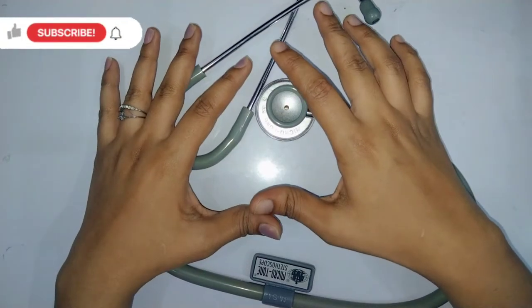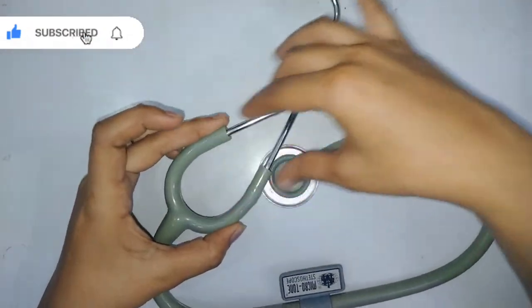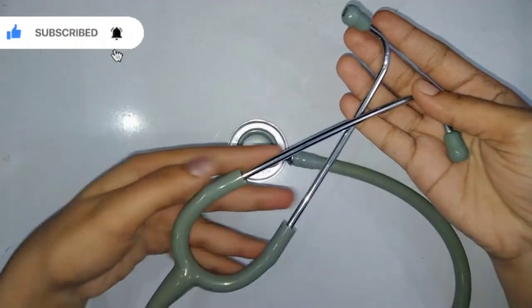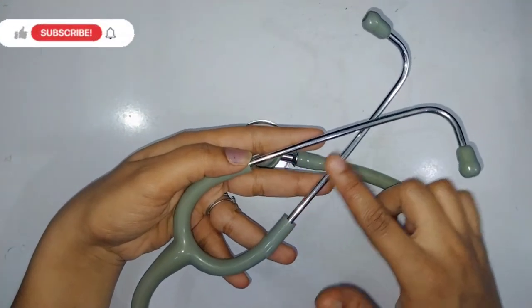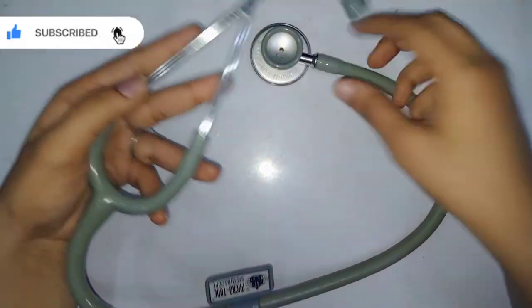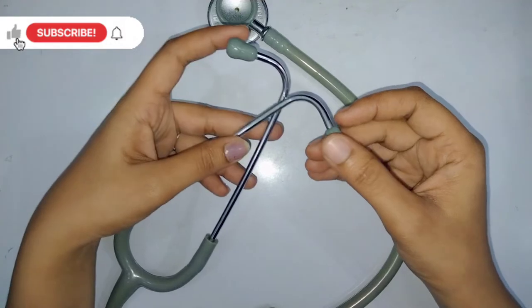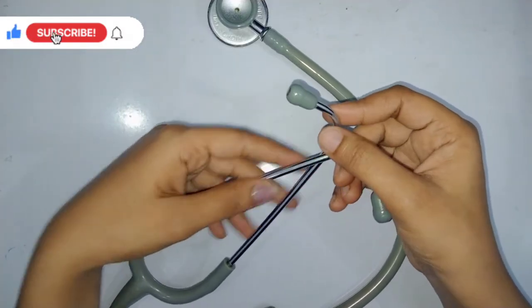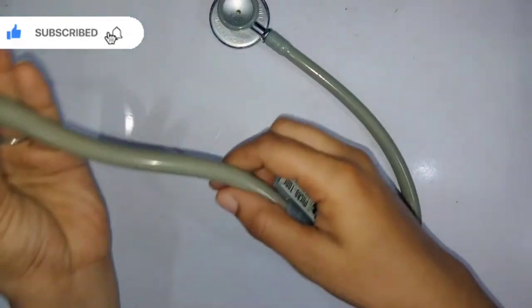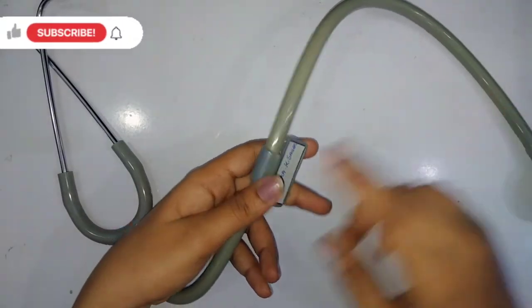The stethoscope has three main parts. The first is the headset, which has binaural metals — these are the binaural metals which maintain tension and are connected to the tubing, which is made of PVC material. These two ends are called ear tips, which are connected to the headset via the binaural metal. This PVC pipe, called tubing, also has a nameplate tag on it.